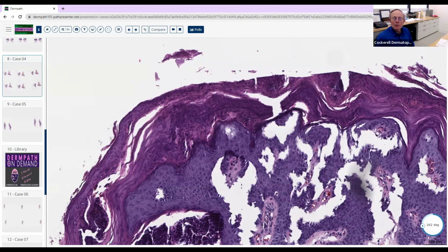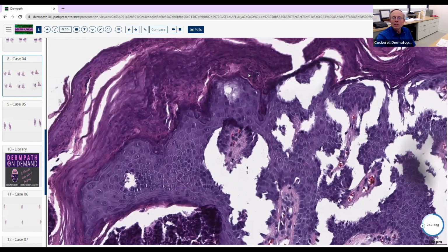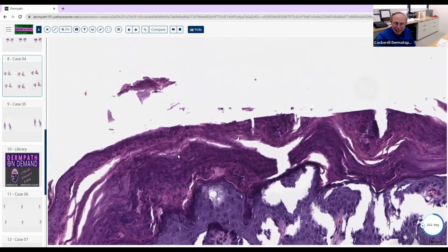And so make sure you bone up on the different forms. They might put psoriasis. They might put erythema on there to fool you. They might put pityriasis lichenoides on there. They might put tinea versicolor. They might put tinea pedis or something like that. So just recognize that this type of cornified pattern is classic for this condition.